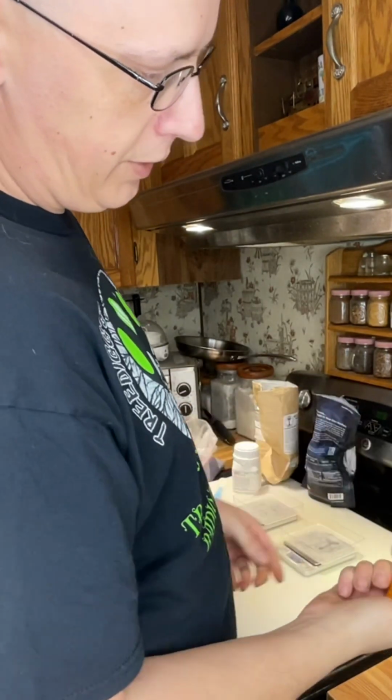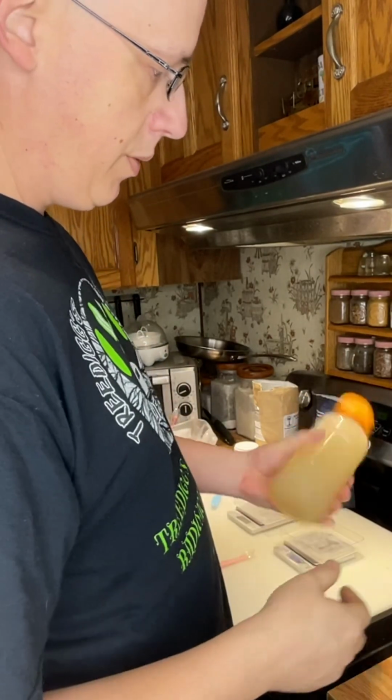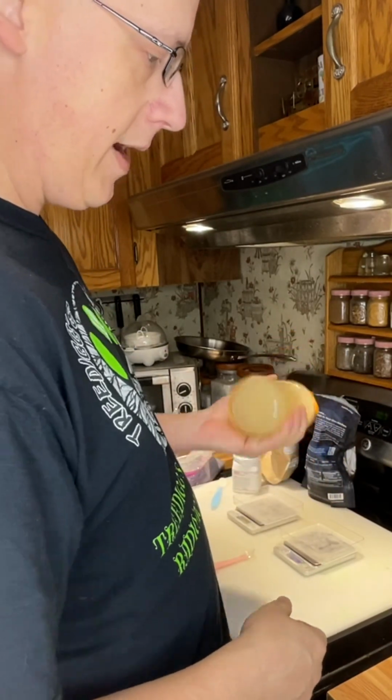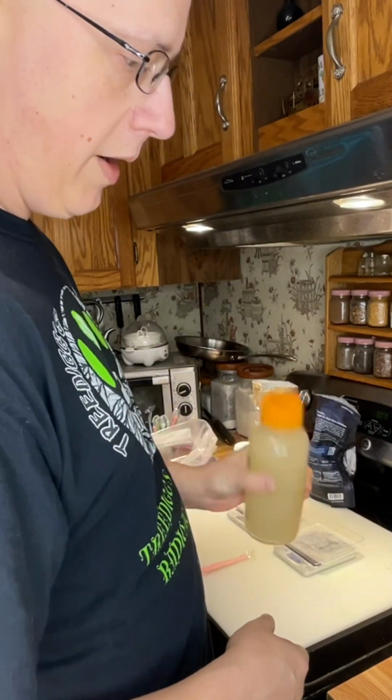And in this case, it mixed up a whole lot better. No chunkies, nothing like that. Usually though, with regular agar, water agar, I would just go ahead and use a small amount of warm water.